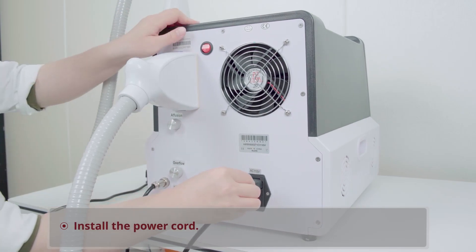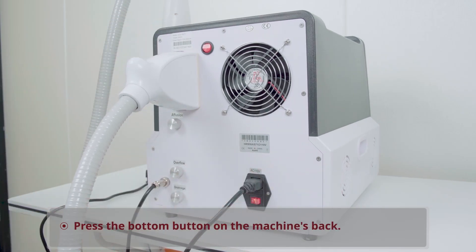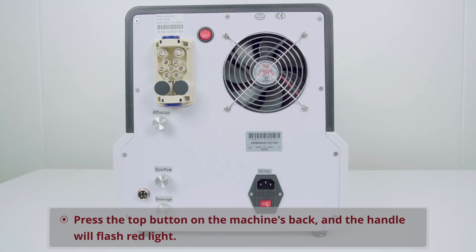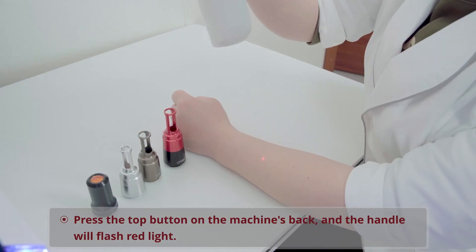Install the power cord. Press the bottom button on the machine's back, insert the key and rotate it to the right to start the machine. Press the top button on the machine's back and the handle will flash red light.